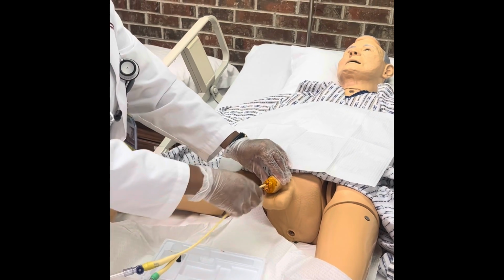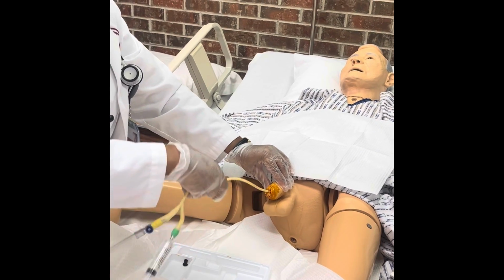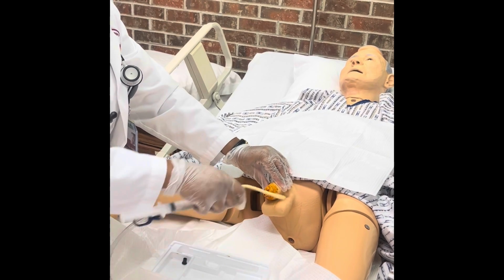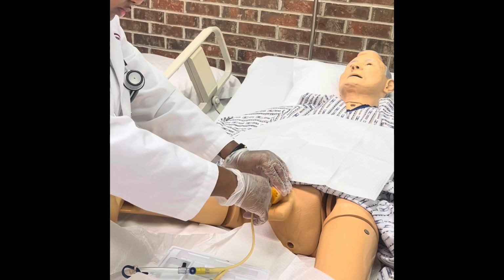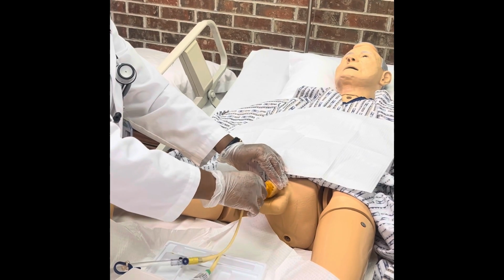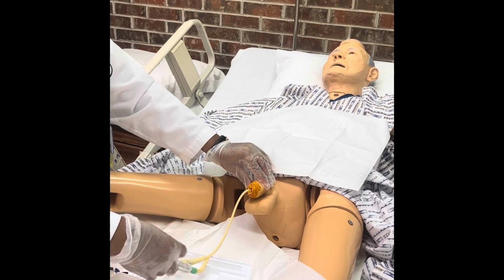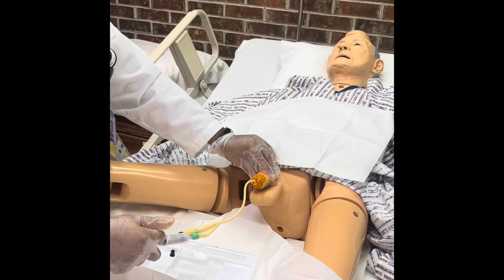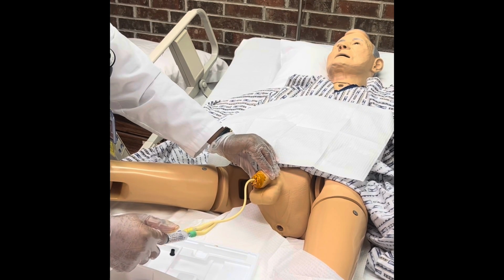Okay. And then I'm going to keep inserting until I get some urine return. Which I did. And then go about 2 more inches. Okay, once I have it in the correct place, I can inflate the balloon using the solution.